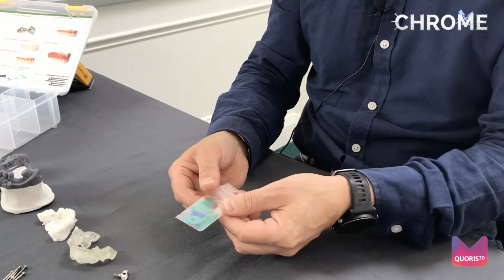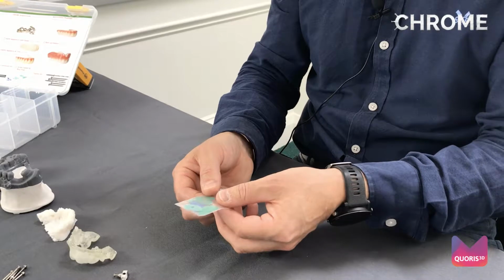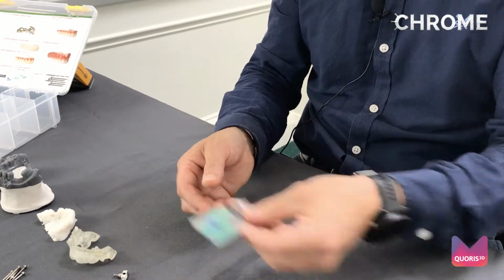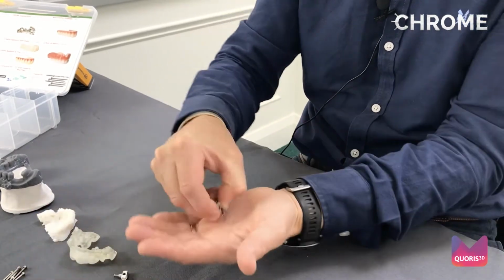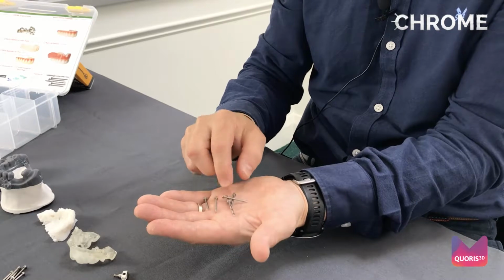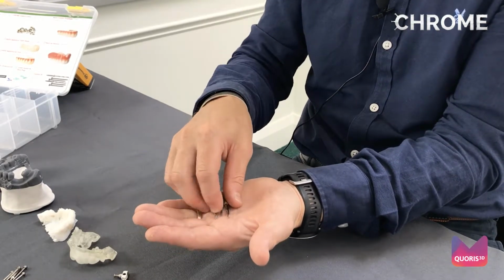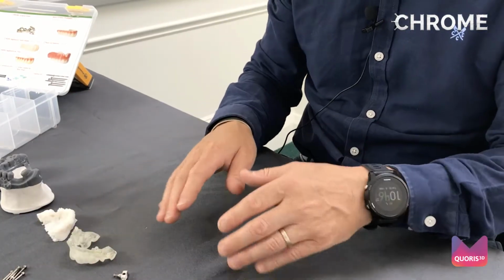And you've got a little bag with your various gaskets to allow you to have ease of transfer and attachment and pickup of your provisional. The last thing are your fixation pins, which you remember from the PDF. In this particular case we are using 4 short, and these need to be pre-ordered. So we'll just run through the case.